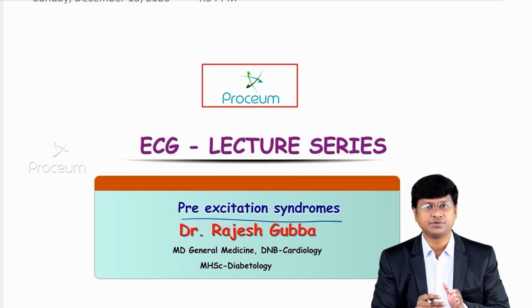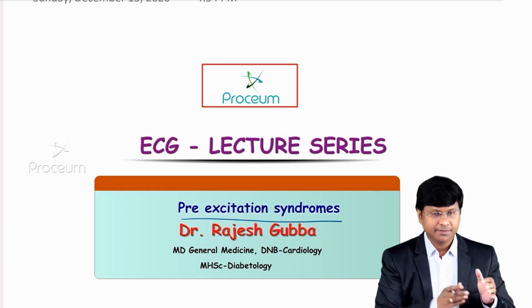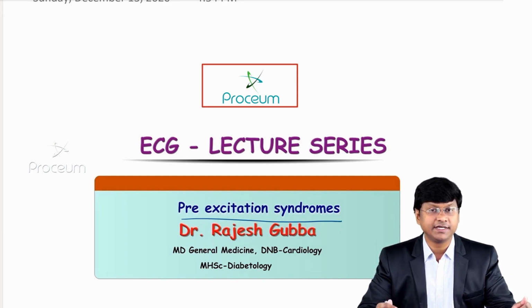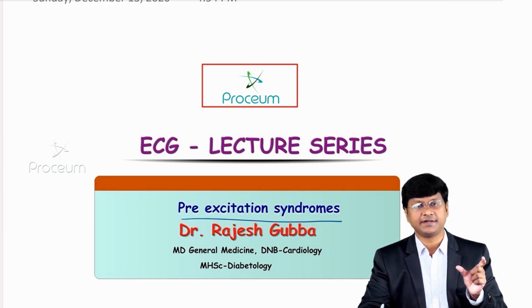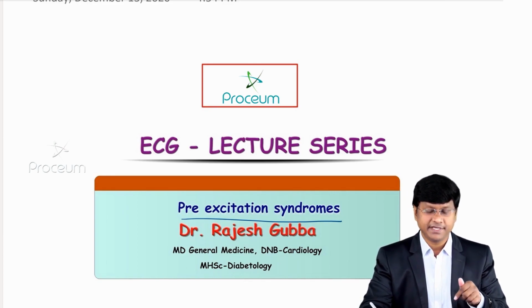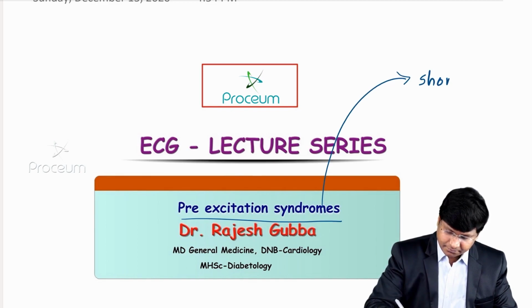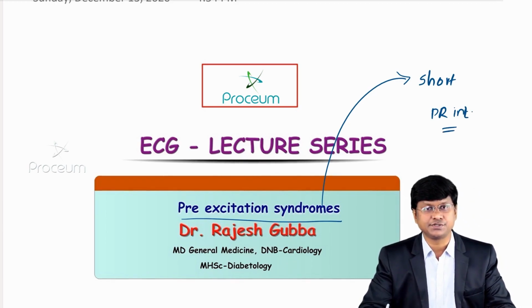So, the pre-excitation syndromes are abnormalities associated with the PR interval. In my sections on the PR interval, I have discussed the clinical scenarios where you will have a prolonged PR interval. That is mainly in case of AV block. In first degree, second degree, and third degree AV block, you will have prolongation of the PR interval. Whereas in case of the pre-excitation syndromes, you will have a short PR interval. That is a very important feature of the pre-excitation syndromes.